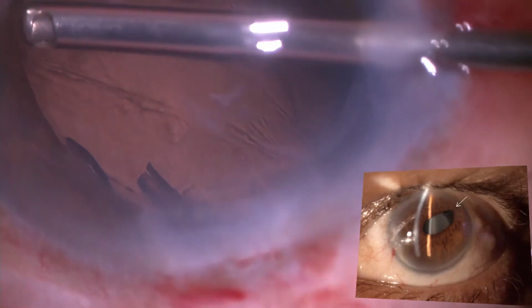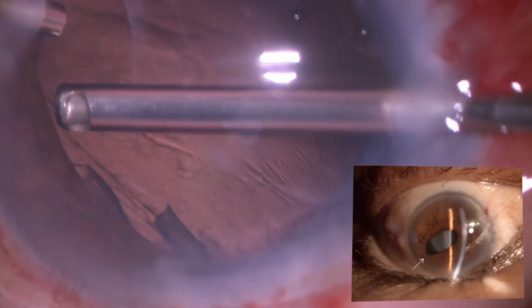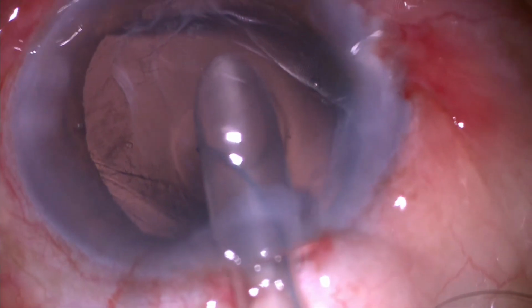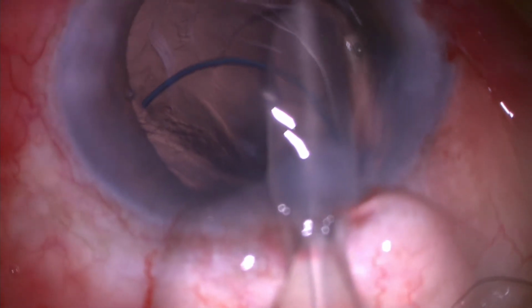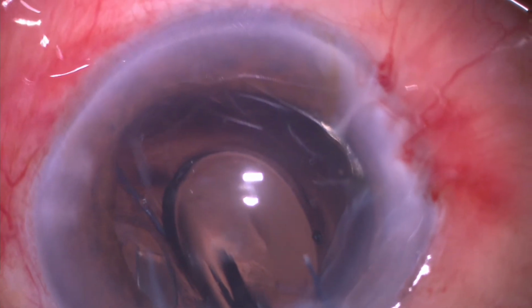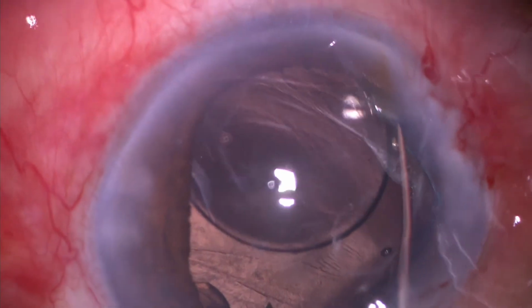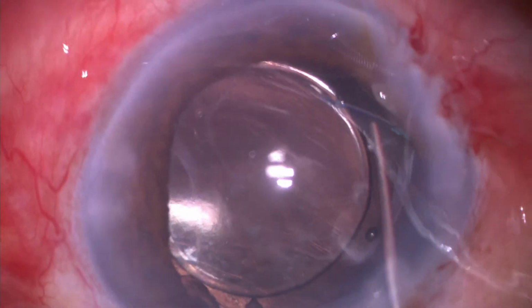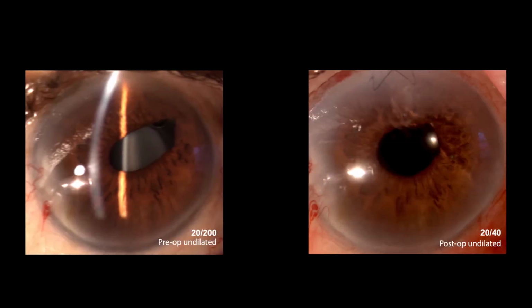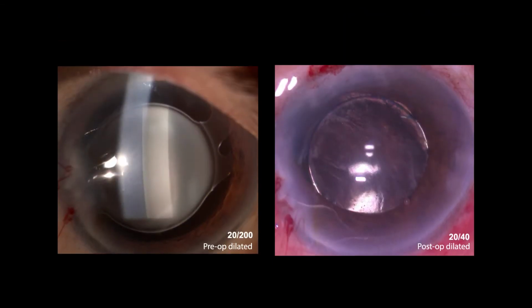Vitreous strands were released by performing a localized vitrectomy. The fibrosed ends of haptics were retained in the bag. During implantation, the multi-piece hydrophobic spherical IOL flipped upside down. However, it was retained in the same position to avoid damage to the capsular support. Post-operatively, a relatively round pupil and improved visual acuity was noted.